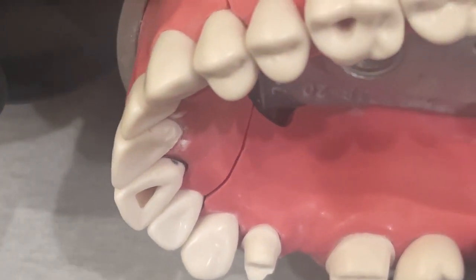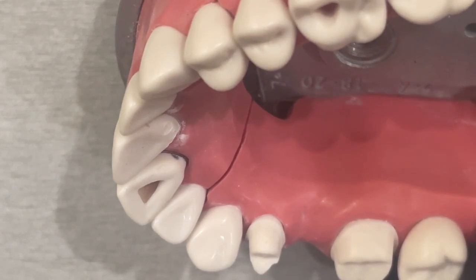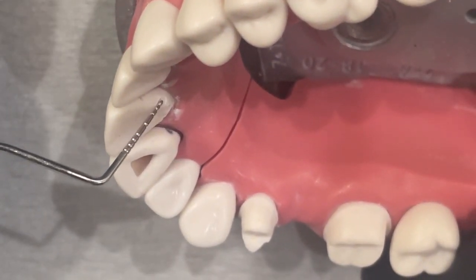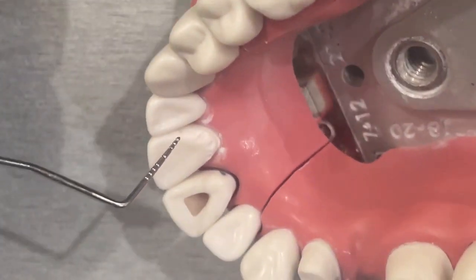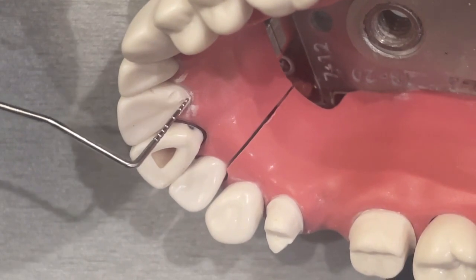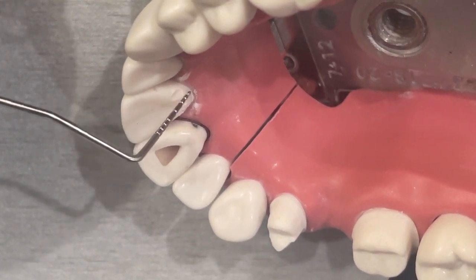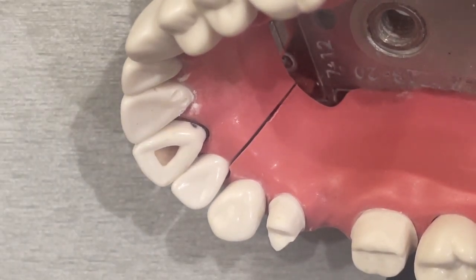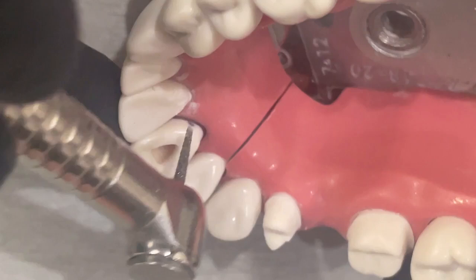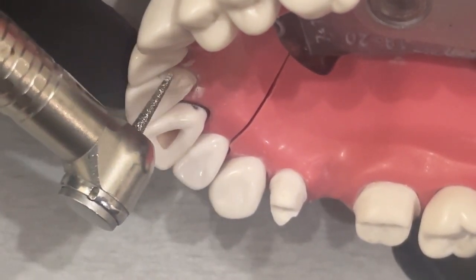Let me show you what these depth cuts look like. If you look at them, they're actually shallow at the top and deeper at the bottom — almost like a teardrop shape — because I'm trying to get that wall. Now I'm just going to join them, keeping my instrument extremely straight, almost forcing it to go the other way, just so I can create a wall down here.